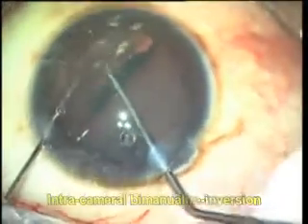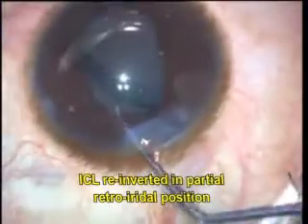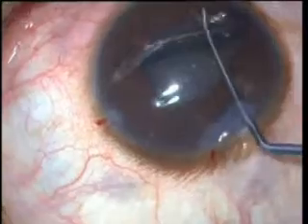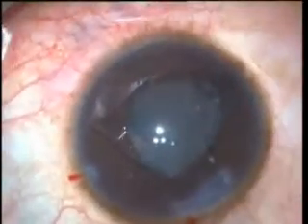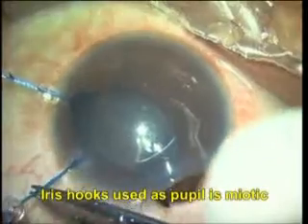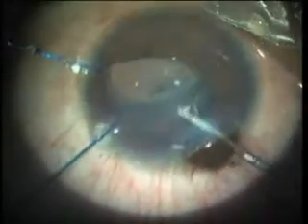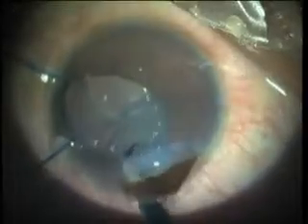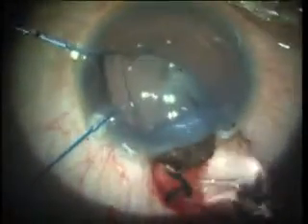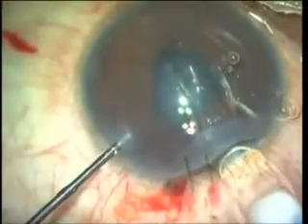This can be done by simply pulling the ICL out, slightly enlarging the incision and pulling the ICL out, or by putting a cut in the ICL and rotating it out of the incision. An inflamed iris and a small pupil may require iris hooks to be used. In case difficulty is experienced in viscocannula-assisted re-inversion, the ICL may be explanted by pulling it out. The ICL is then re-implanted carefully.